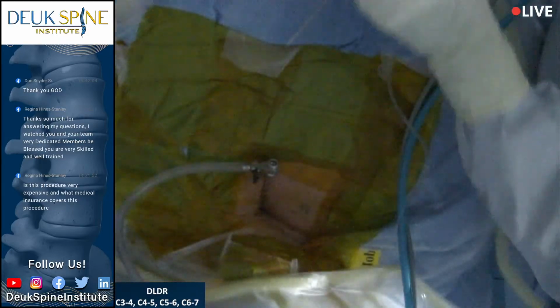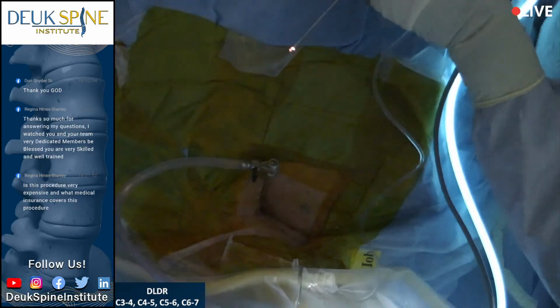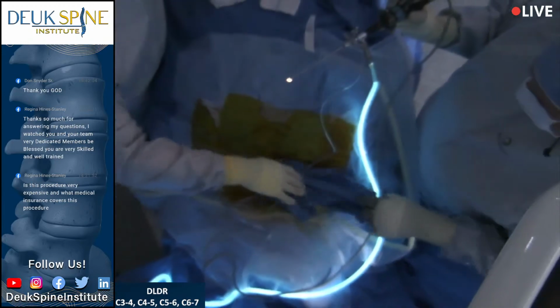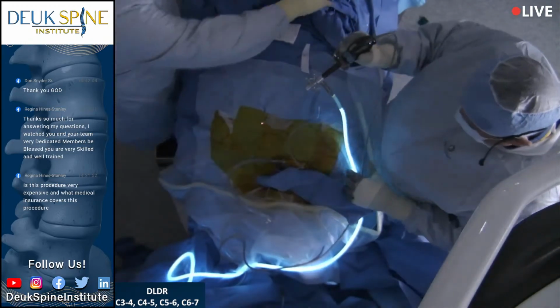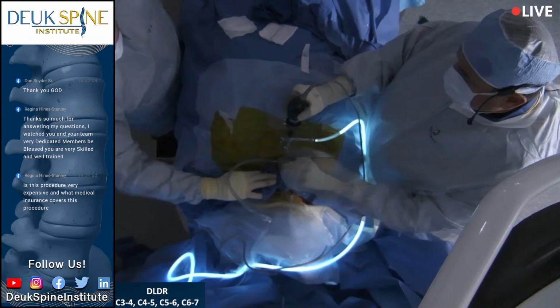Whoa, what's pulling? That was weird. Okay. For those of you watching, we made it into the 6-7 disc, which honestly we weren't even thinking we'd be able to, but somehow we did. So let's get on with it. Going to do this disc and then hopefully 3-4 and we're done.